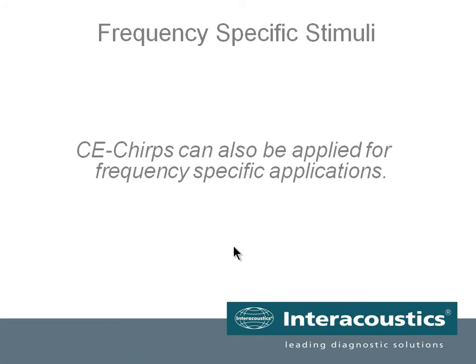Frequency-specific stimuli are also possible using this kind of CE-Chirp technology.